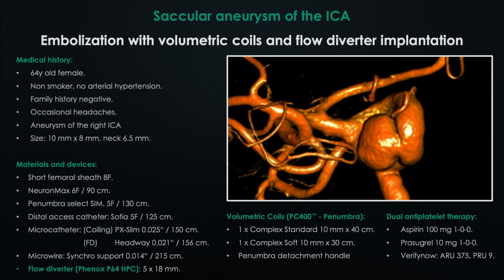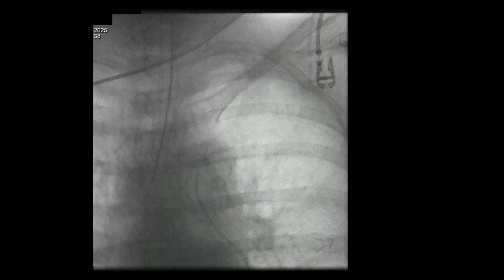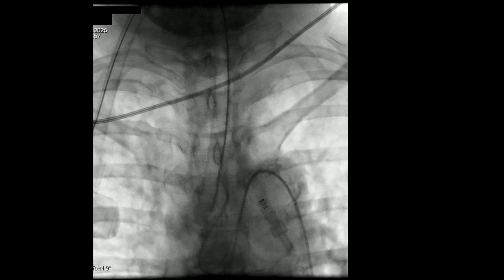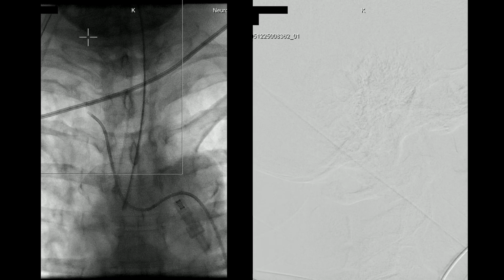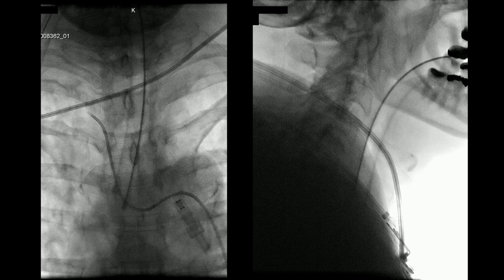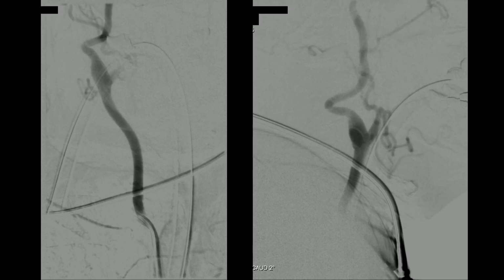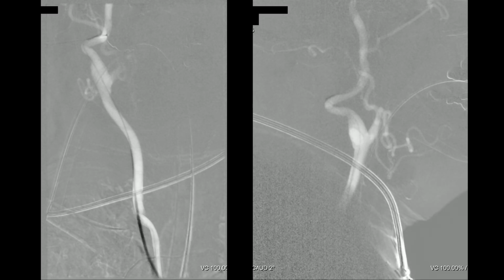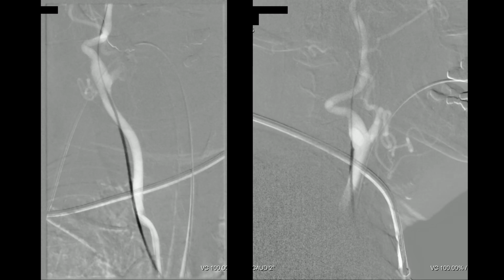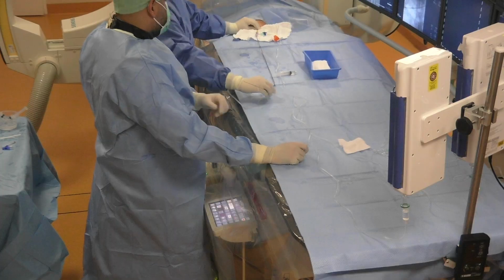And here we go. We push the long sheath NeuroMax with the select catheter into the aorta, configure the select catheter, and go inside the right common carotid artery. Now we need a roadmap to see the anatomy upwards. There is a kinking of the ICA, that's why we should be careful here, and we should push the NeuroMax long sheath only to the origin of the ICA.